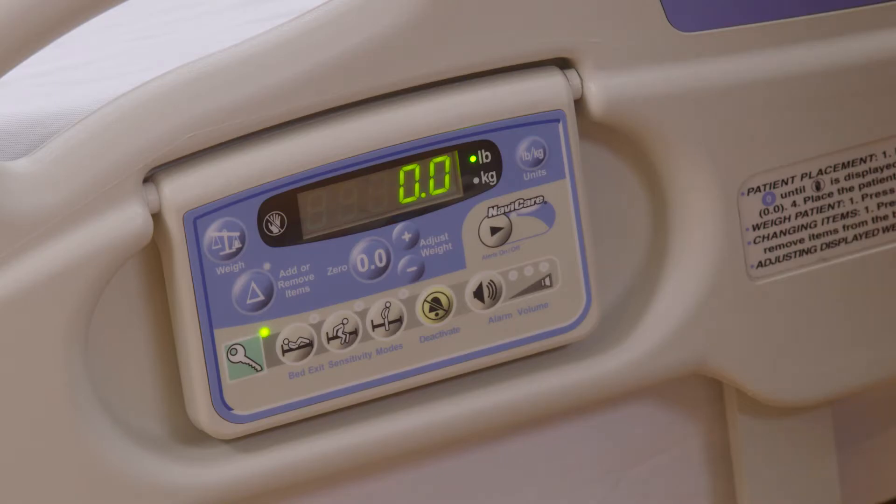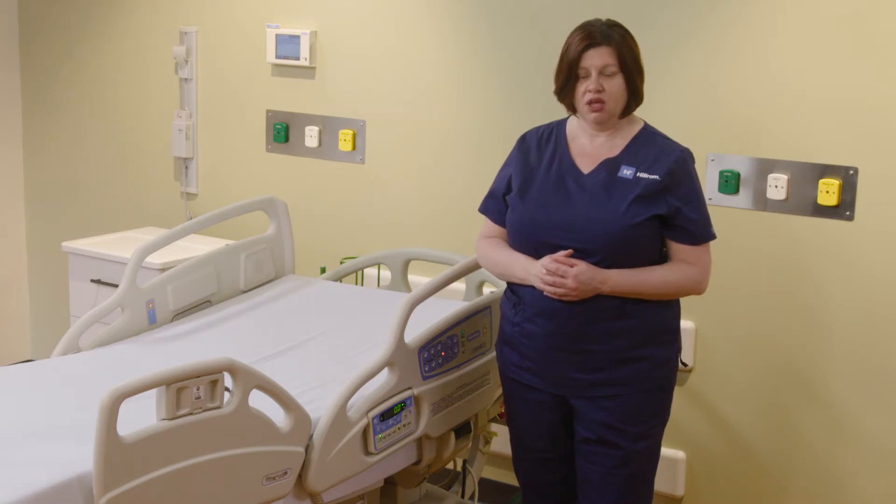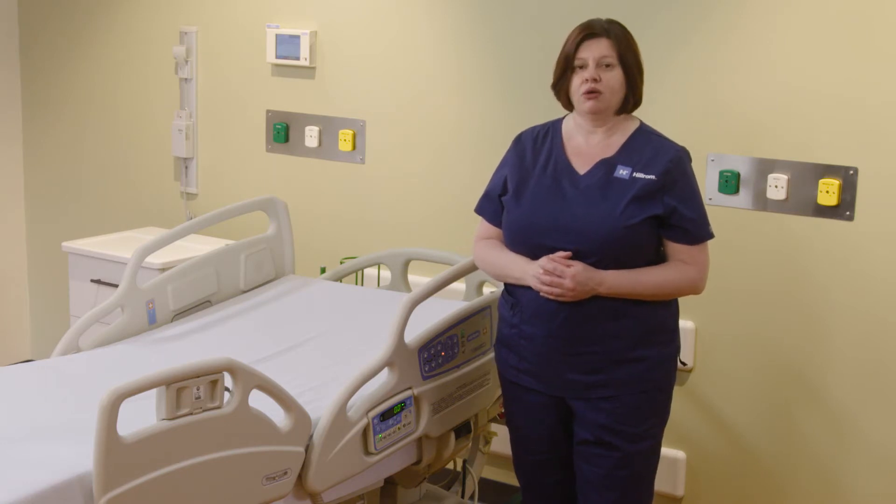When it displays 0.0, your bed is ready for a patient. We will place the patient on the bed and then weigh our patient. Please make sure when you zero the bed and when you weigh your patient, you are following your facility protocols around objects to be on the bed during zeroing and weighing.